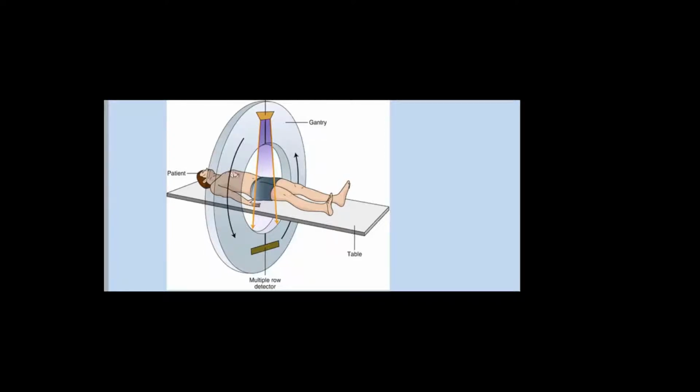The temporal resolution is the ability of the imaging to scan a moving structure. How fast the imaging technology can cope with a moving object so as to freeze it and avoid blurring in the image. The temporal resolution is measured in seconds and milliseconds.